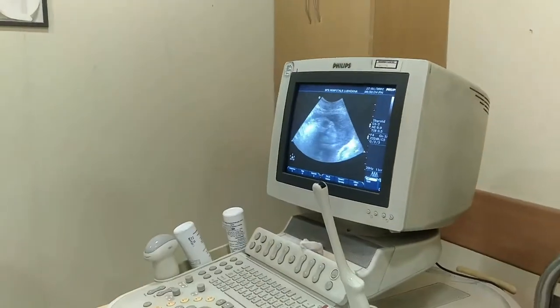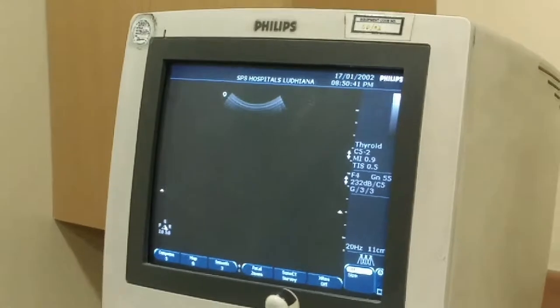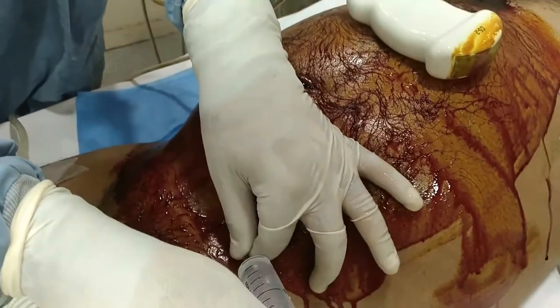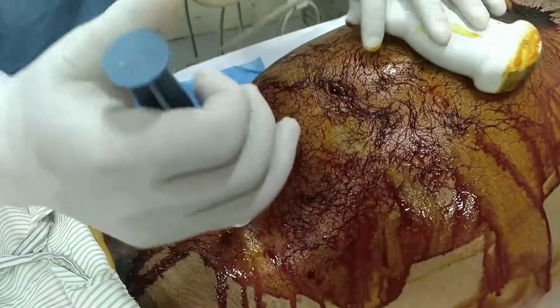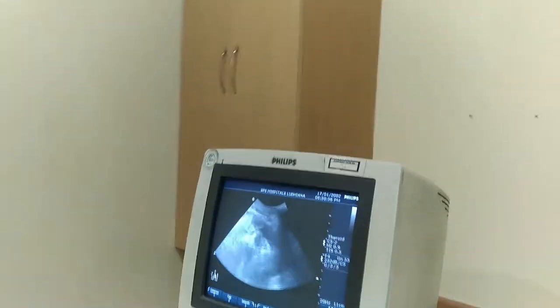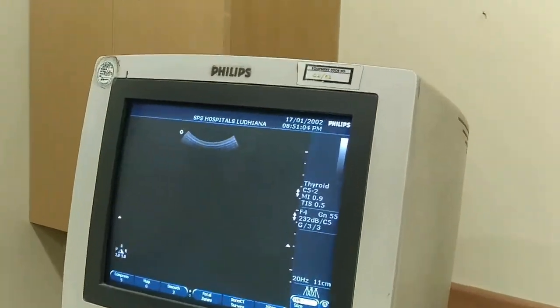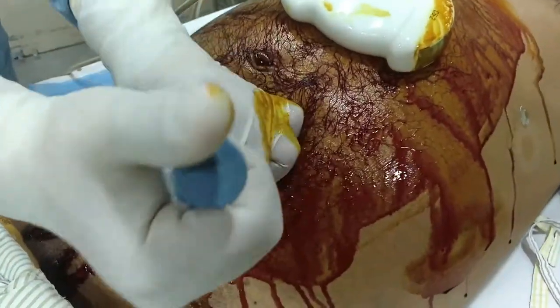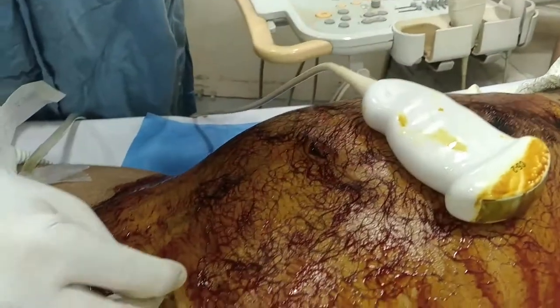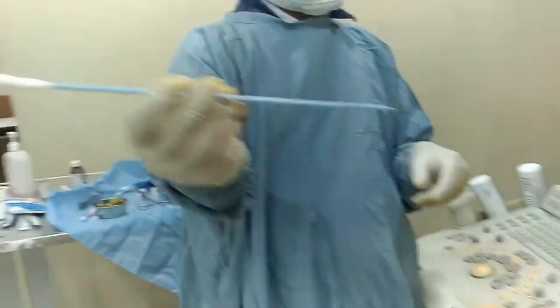We start with the pelvic one. This is the pelvic area, so this is where we will give our first anesthesia. After local anesthesia, we give a stab incision and proceed with a cannula-based approach.